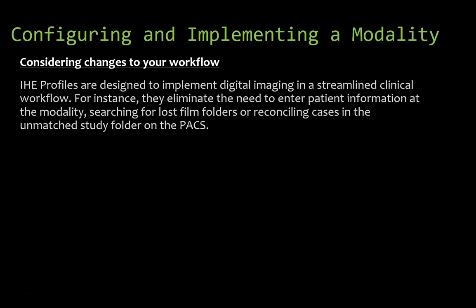You might think the process for sending images to PACS is simple, and it should be. The tech chooses the correct information from the modality worklist, does the scan, sends the images, the accession number matches the order. It should work perfectly every time. But it doesn't, and there's an unmatched study folder in every PACS system where studies that do not match any order information in the PACS database stay until the PACS admin figures out who or where they belong. Like we talked about last night, a lot of those will be QC images.